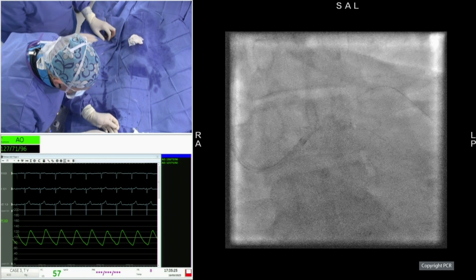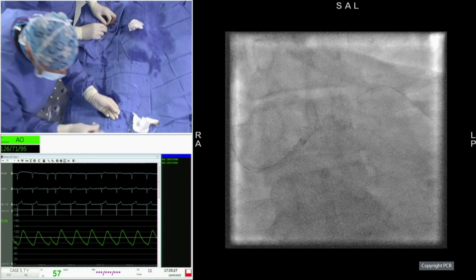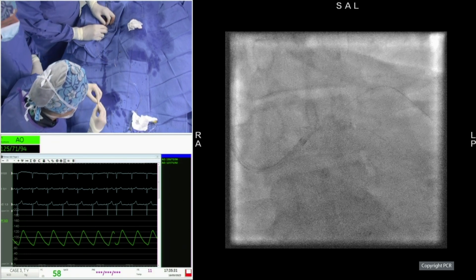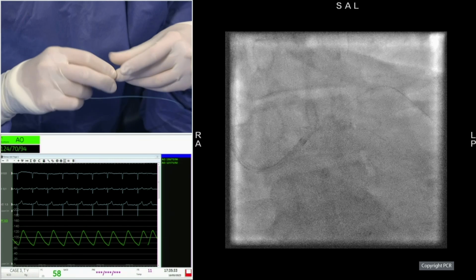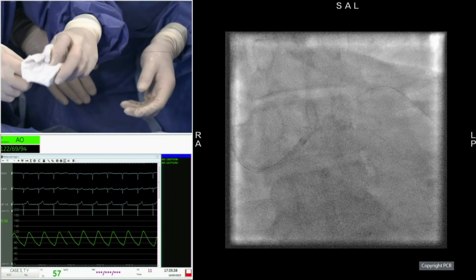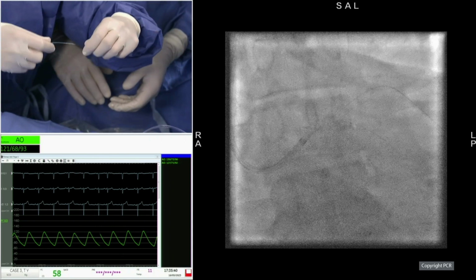Any question, Jean, from the auditorium? There was a question concerning the plaque preparation for Bruno during this time Antoine could work. Well, it was concerning the indication of rotational atherectomy in this particular anatomy.